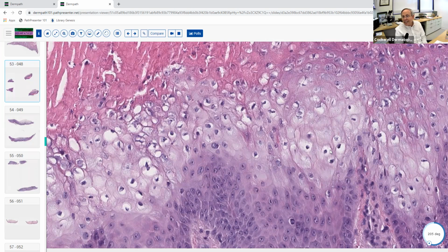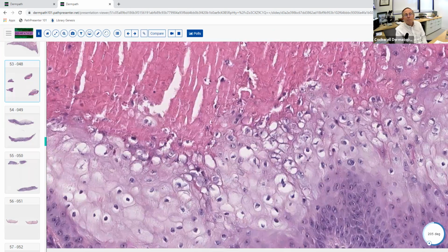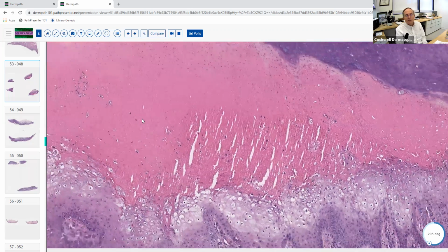So they're infected, or there's something going on with them that causes them to die, like they're dying up here. And if you look carefully inside the cytoplasm of some of these, there are these little pink eosinophilic inclusions, like right there. Hard to recognize, but you can see those. And then it's forming this large eschar, not really purulent, it's really more of an eschar with dead epidermis and some inflammatory cells and some serum at the surface of it.